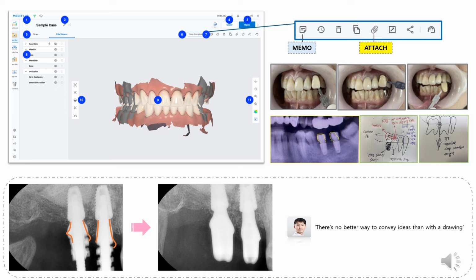The picture below illustrates a classic technique that Dr. Zhang used 10 years ago. At that time, we would print and attach periapical X-rays with copings to all custom-made cases, draw the envisioned shape of the custom abutment on them with a marker pen, and send them to the lab. Although this method was cumbersome, it was undeniably effective. We continue to believe that a picture is superior to conveying information compared to dozens of characters of text. Therefore, we still prefer to send various detailed information as attachments.